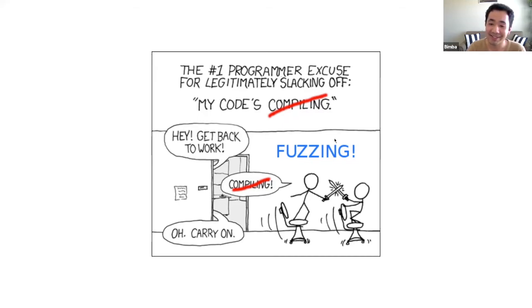And the other thing is there's a whole bunch of stuff you can catch with unit tests much, much faster than fuzzing. So this doesn't mean you should just not write unit tests or integration tests. Fuzzing is just going to catch weird bugs that you would never think to test for. But the bugs that you can think to test for, you should probably do with unit tests, because you'll have a much clearer error message in case something breaks. You're not going to have to dig through this giant log of address sanitizer stack trace, whatever. You'll just get something really nice like this assert failed. So fuzzing is not the answer to everything.